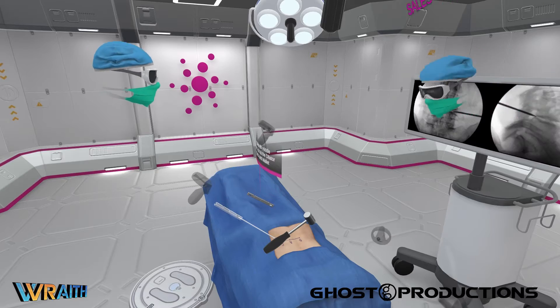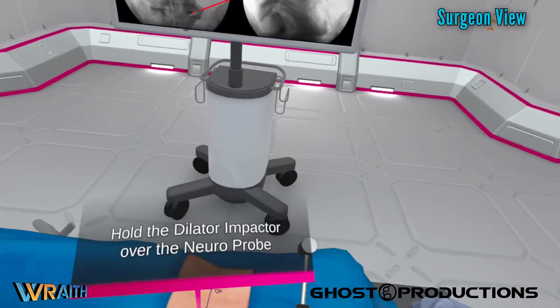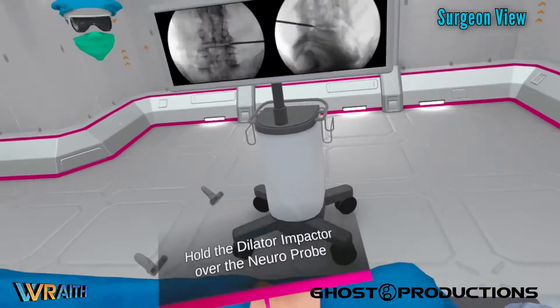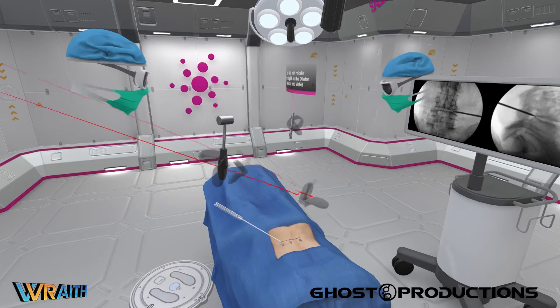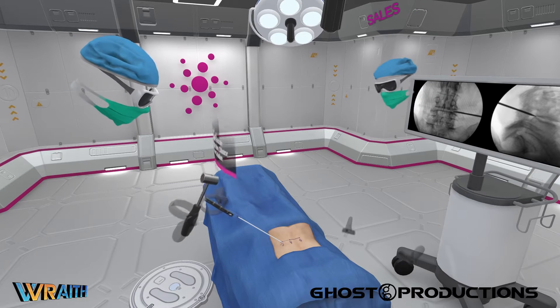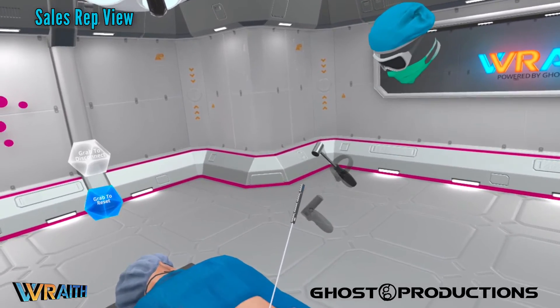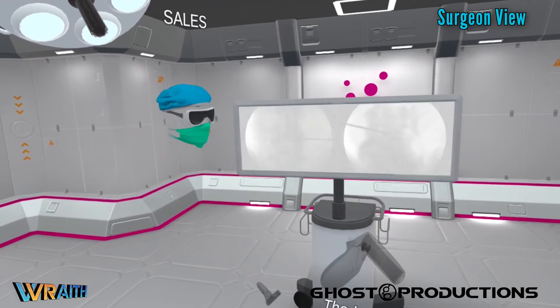I just felt it vibrate — that was letting me know I had hit the end? Yeah. What you've engaged is the annulus for the L4-L5 disc space. We'll get confirmation on both lateral and AP view. You can see that the tip of the neural probe is right at the margin of the annulus, right through Kambin's triangle. Now we'll use this impactor to advance the neural probe roughly five millimeters into the disc space, then get more confirmation through fluoro.